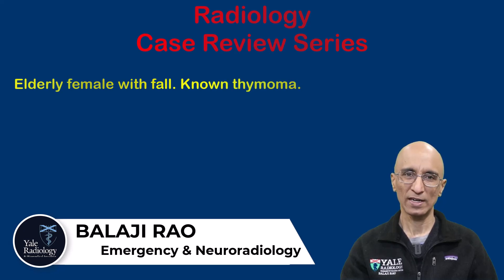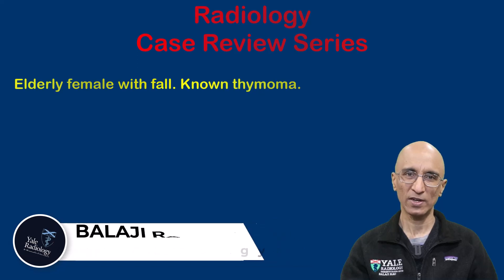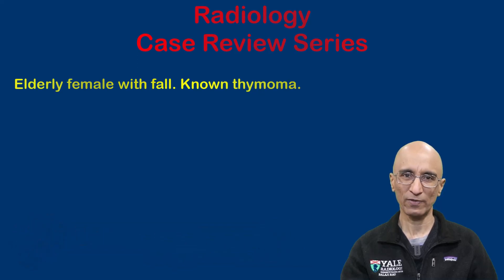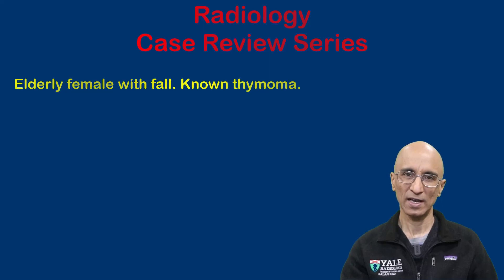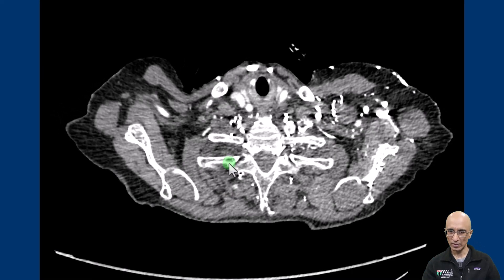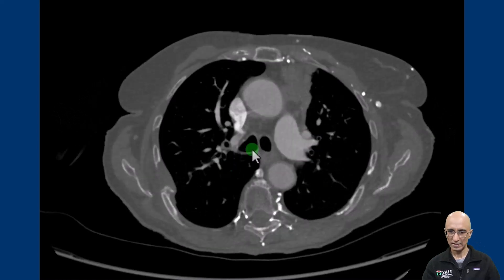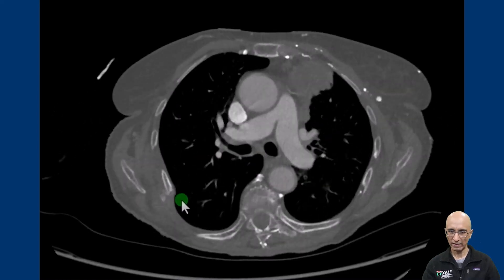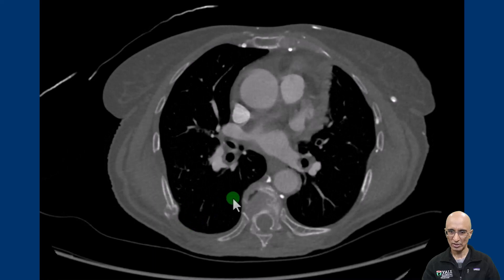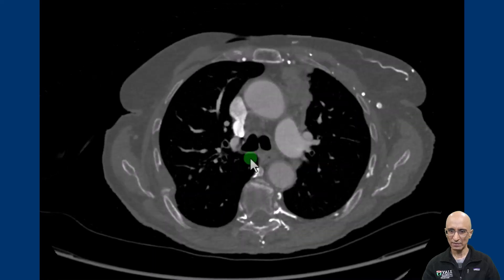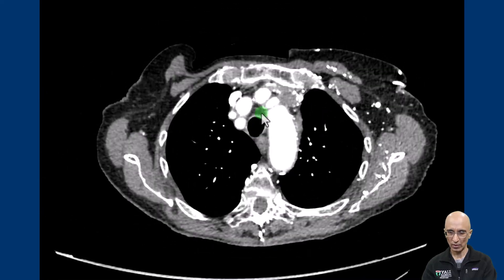The patient had a known diagnosis of thymoma. On the chest radiograph we saw multiple right-sided rib fractures, which led to CT examination as part of a trauma series workup. As we scroll through the CT examination on the bone window, we can see multiple right-sided rib fractures, some of which look subacute, which was also seen on the chest radiograph.